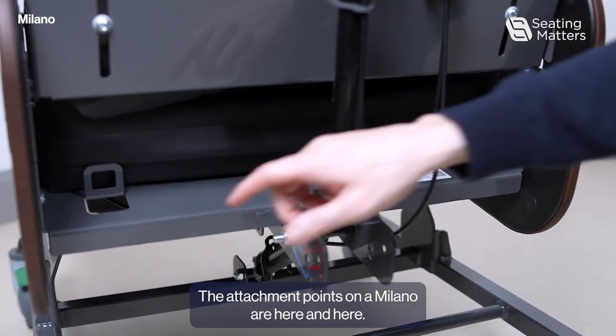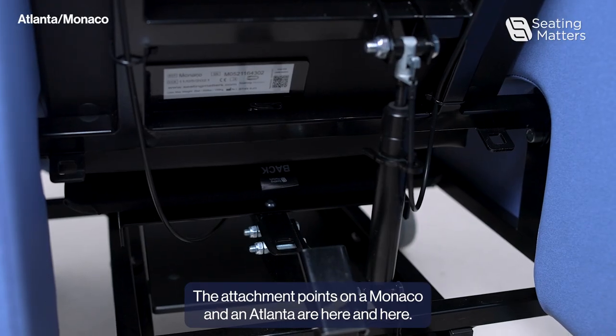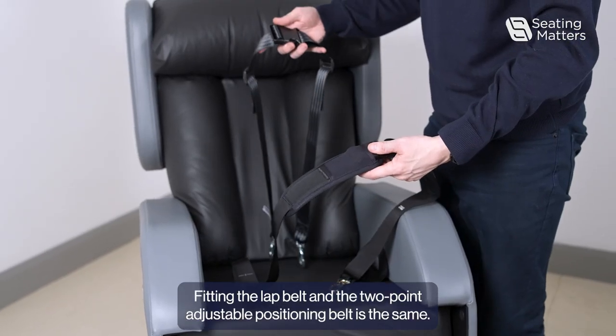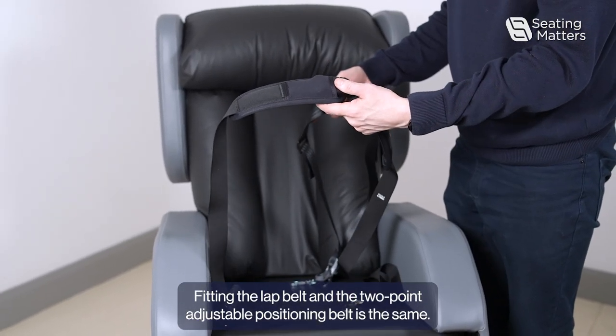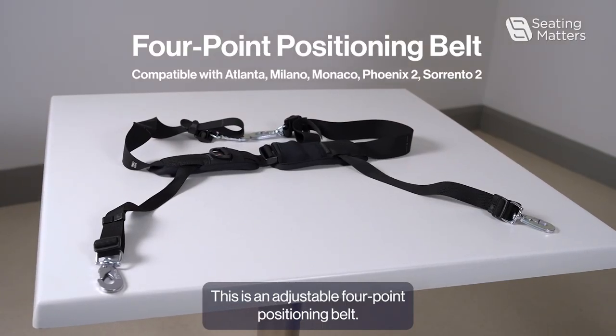The attachment points on a Milano are here and here. The attachment points on a Monaco and an Atlanta are here and here. Fitting the lap belt and the two-point adjustable positioning belt is the same.